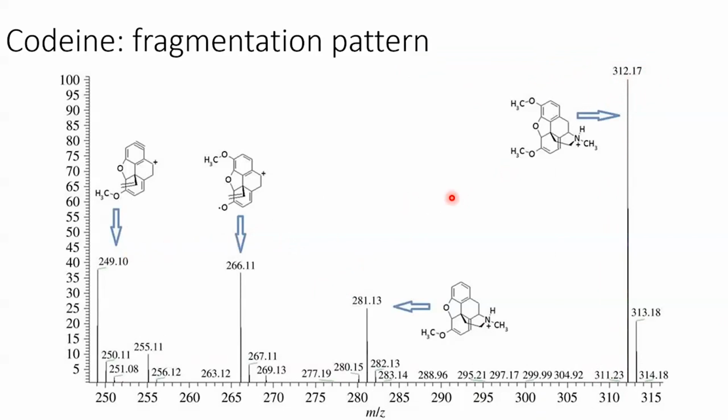And as you gain more experience with mass spectrometry, you'll also come to realise that there is a logic to how these molecules fragment. So one thing about chemical structures that you probably know is that these aromatic rings, these rings of carbon shown here, are very, very robust or strong. They don't break apart easily. And if we have a look at each of these fragments that are assigned, we have this same ring of carbon present here. And that begs the question, so what are the weak points in our chemical structure? So where is fragmentation probably going to occur?